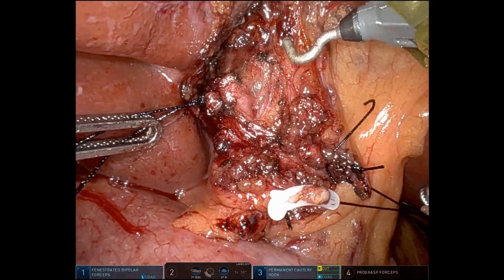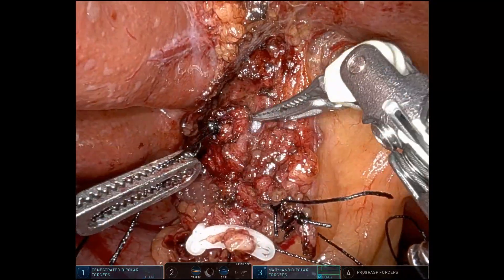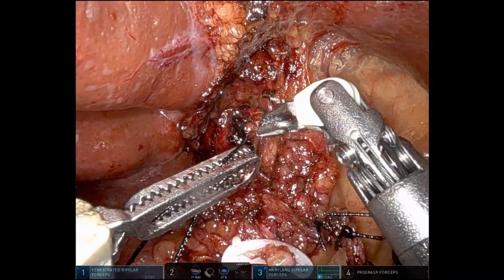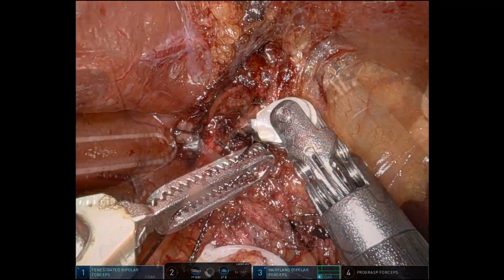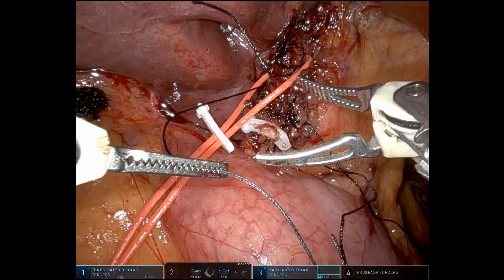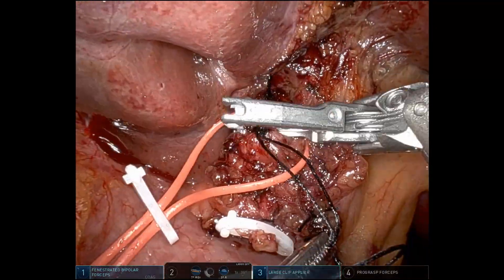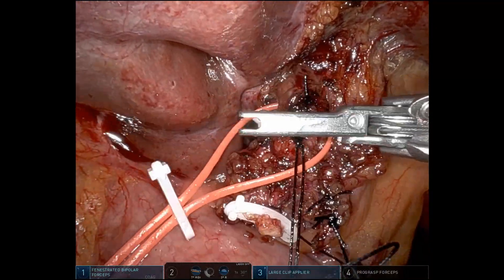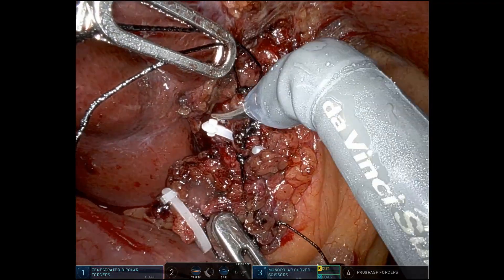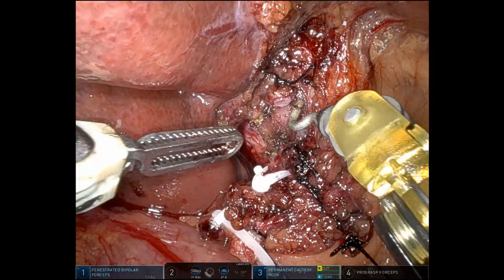Here we have the right hepatic artery that we are isolating. You can see that tie there is actually on the stump of the cystic artery. Here we're encircling the right hepatic artery. There were no arterial anatomic variants in this patient. Likewise here we're going to place a silk tie proximal and then weck clip distal. We're also placing a silk tie on the liver aspect that we can use as retraction to expose the underlying portal vein.